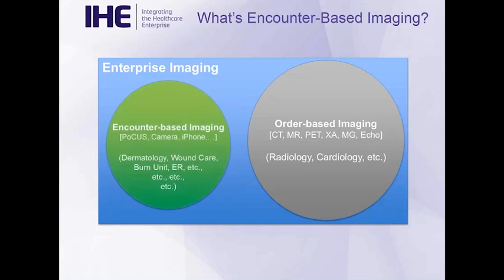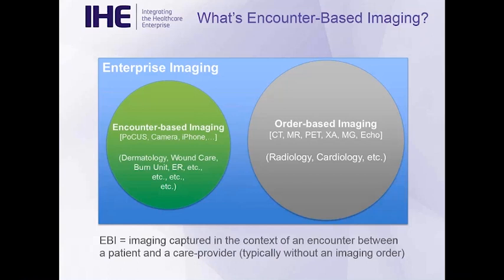Now we're starting to look at another chunk, and there were a number of people presenting on this over the past 2 or 3 or 4 years, particularly at SIIM, for example, referring to what we're starting to call encounter-based imaging. And so this means imaging that's captured in the context of an encounter between a patient and a care provider, but there isn't necessarily an order. In fact, frequently there isn't. This is more ad hoc imaging.